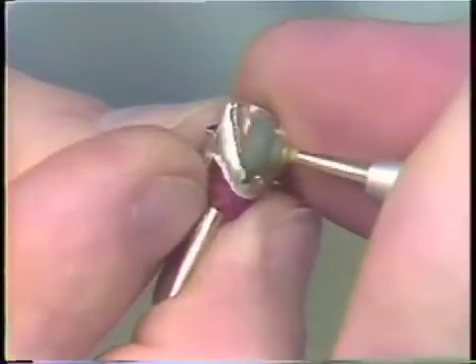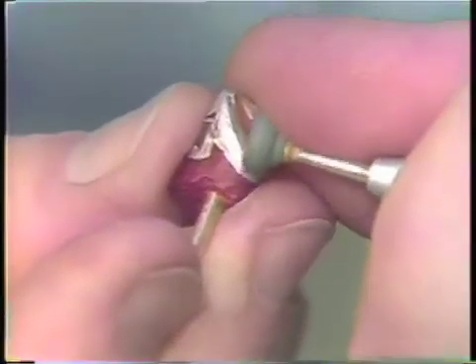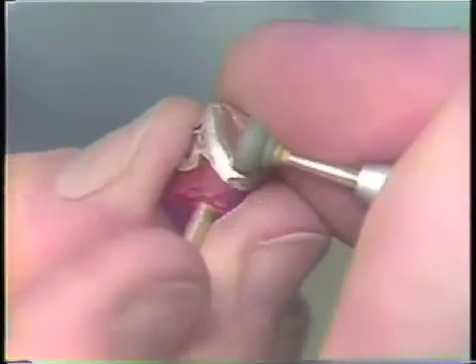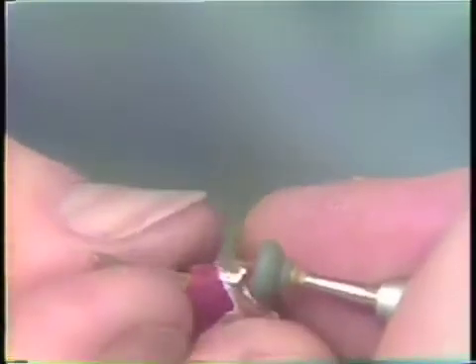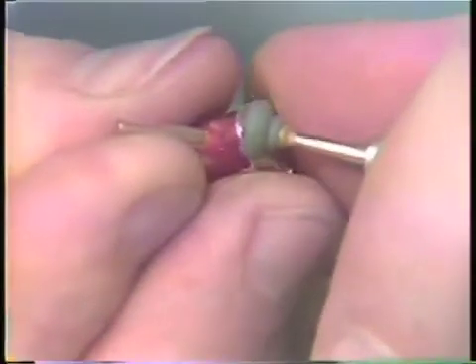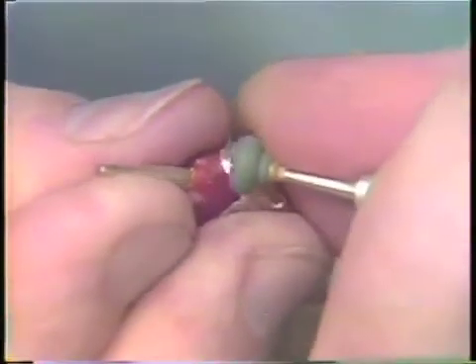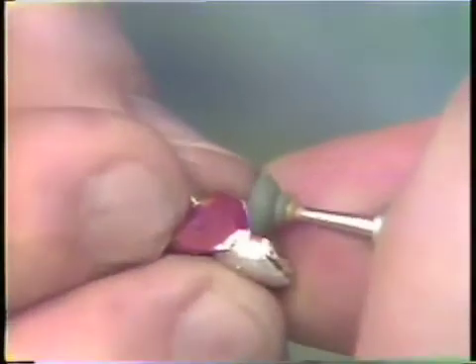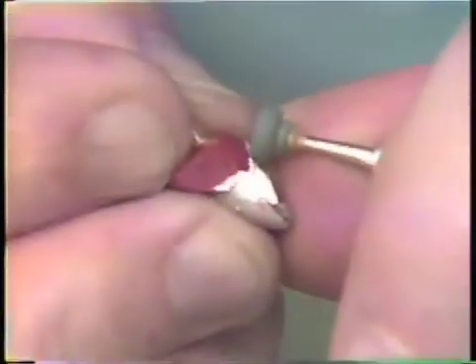A number 11 greenstone is used to thin the margins. The margins have been purposely bulked in the wax pattern stage, and now the margins will be thinned. We will run this greenstone parallel to the margin, trying not to cut the die. The purpose of this is to give the casting the same contour of the original tooth.